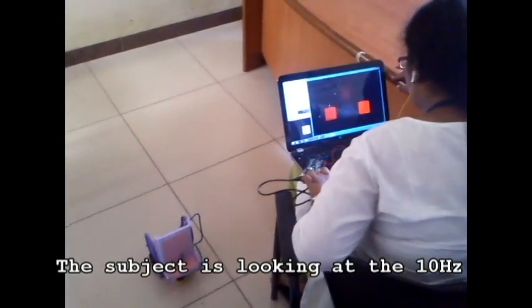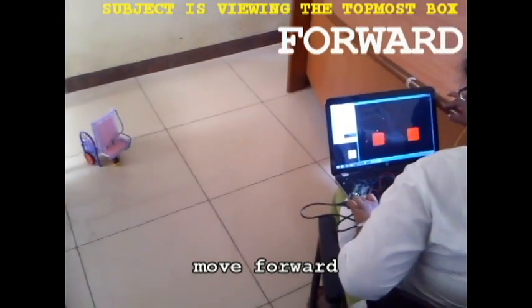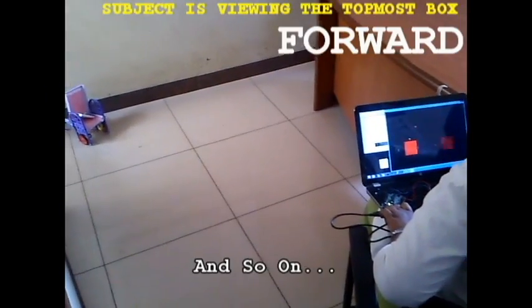So here is the demo. The subject is looking at the 10 Hz flicker box and this is making the wheelchair move forward. Now she is focusing on the 12 Hz flicker which makes it turn right and so on.